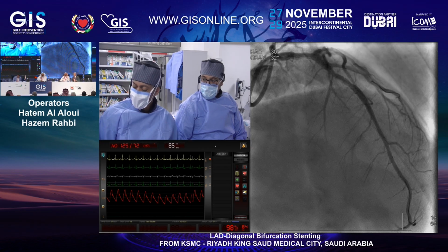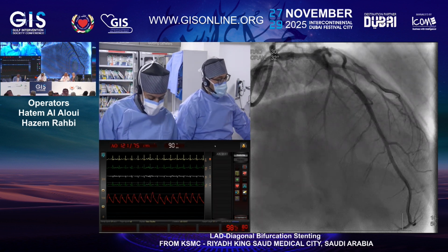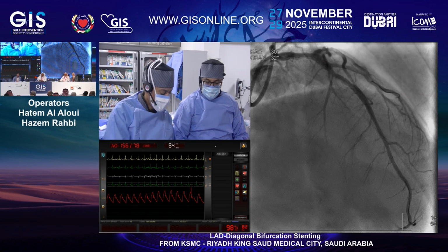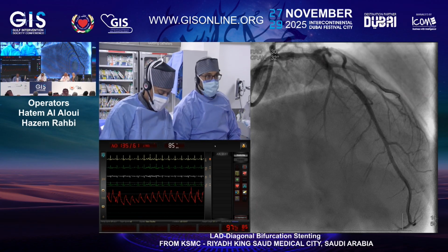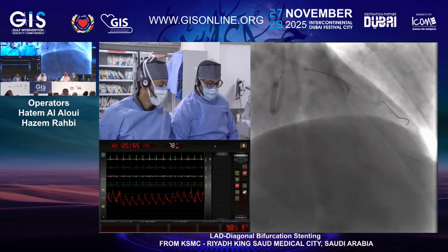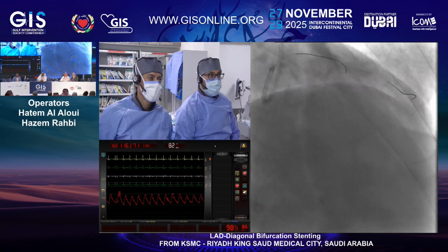Let me ask the audience. We have a question from Dr. Abdullah Shahab. What are the concerns here? Is it that focal lesion of the LAD? Why do you want to put a stent?